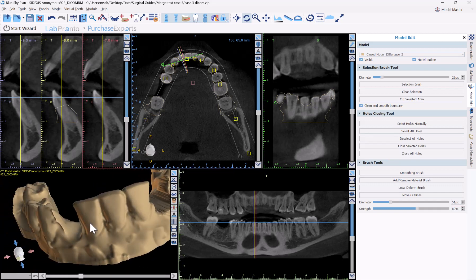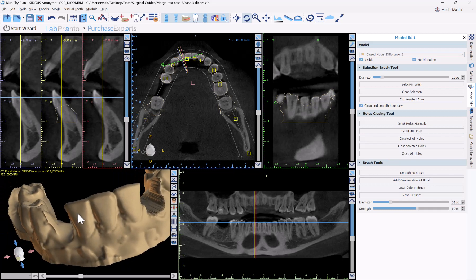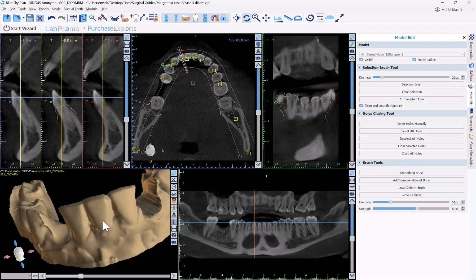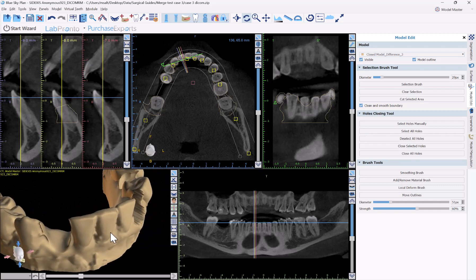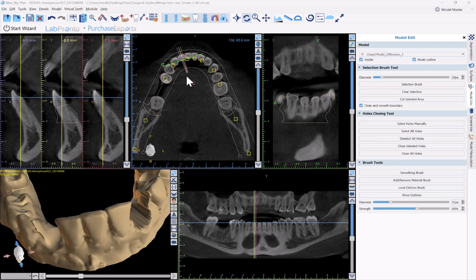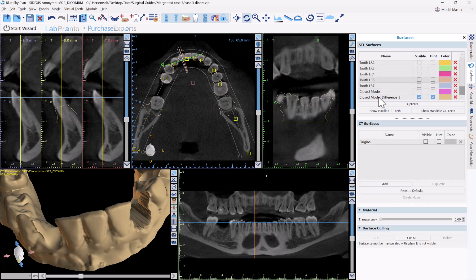These are several different techniques — you can use different ones for different situations, and you might find one more appropriate than another. The main pointers are: always confirm you're operating on the correct model, always confirm you have the correct model selected from the dropdown view. In surfaces, it's also a good idea to double-click on the name of the model and give it a meaningful name so you can keep track of which surface is which.